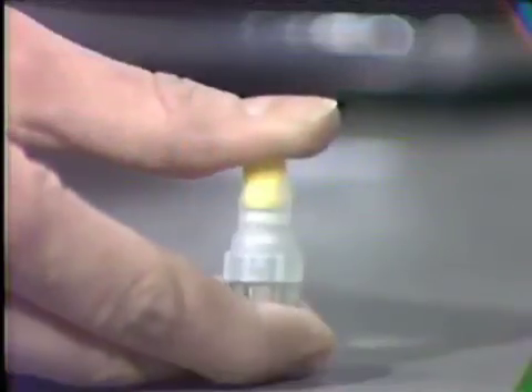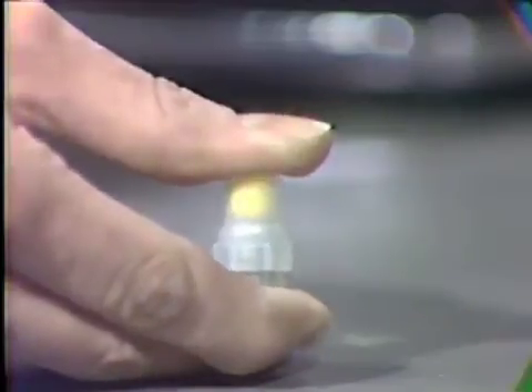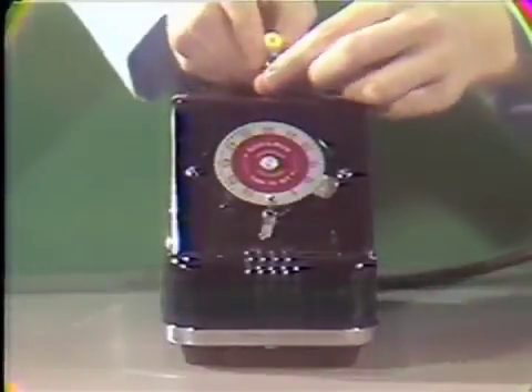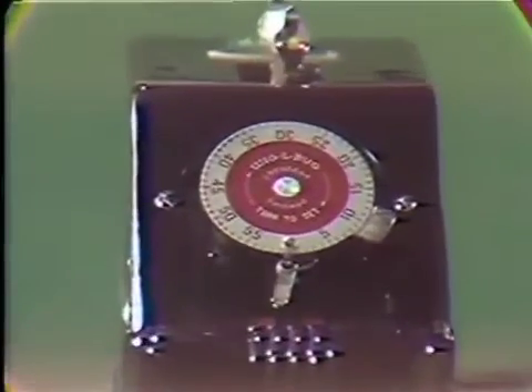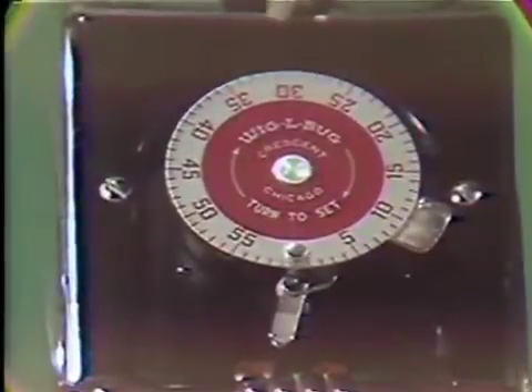Once you have depressed the plunger and forced the mercury and pestle into the lower chamber, the capsule is then ready to be placed into the amalgamator. According to manufacturer's directions, mix for the correct amount of time. This type of amalgamator uses a mixing time of 15 seconds for a single spill and 20 seconds for a double spill.